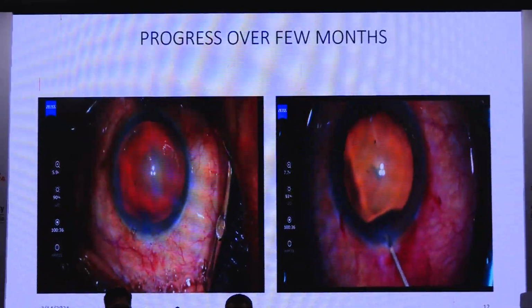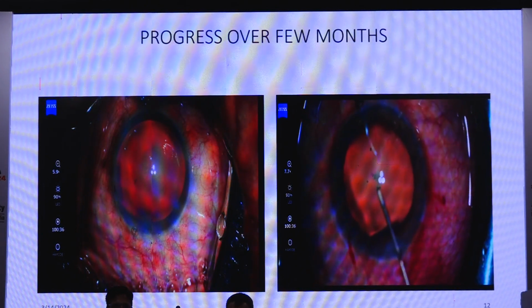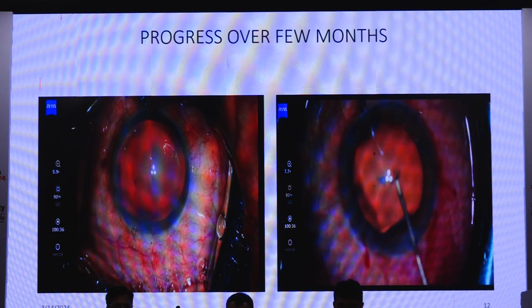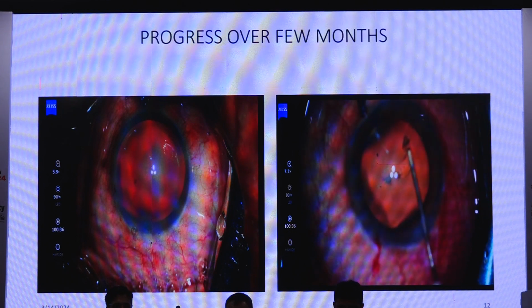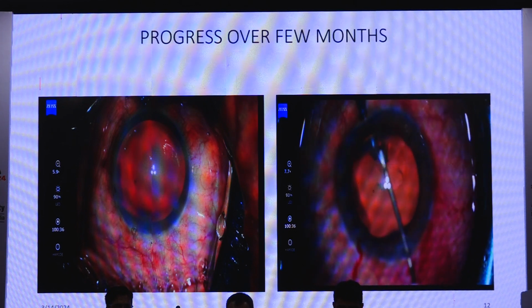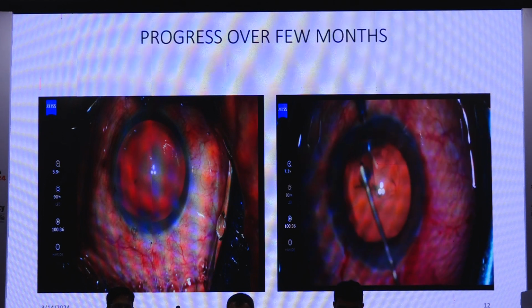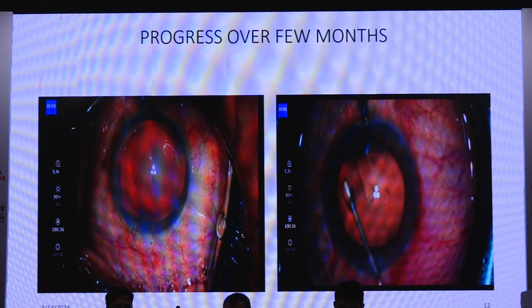So having a simulator at our center proved as a boon for us, and this is my own comparative video of capsular access in a real eye from my residency days. On the left, this is a video in which I could not even manipulate my instrument inside the eye, and my hand was covering the surgical field. But after a few months of training on the simulator, I could easily maneuver my instrument inside the eye and smoothly complete the rhexis.